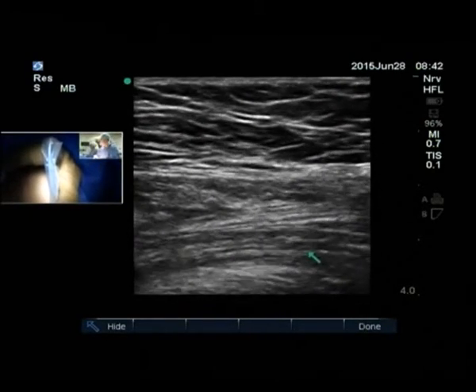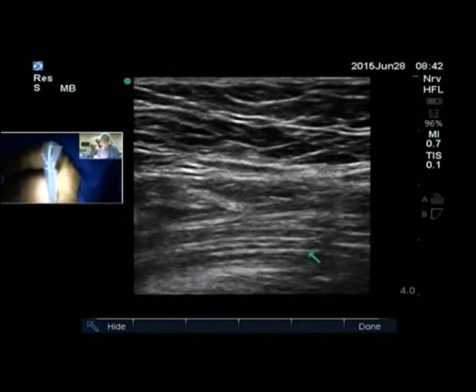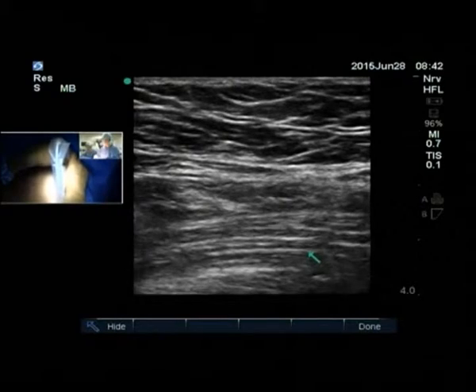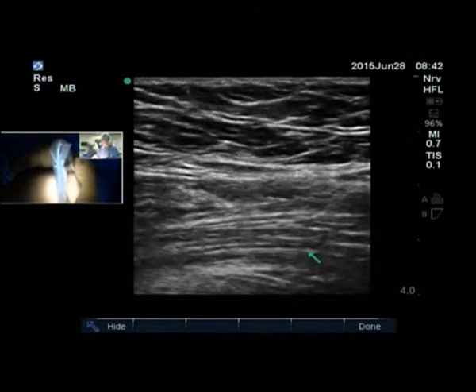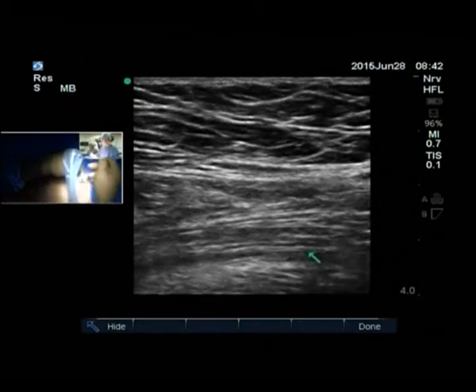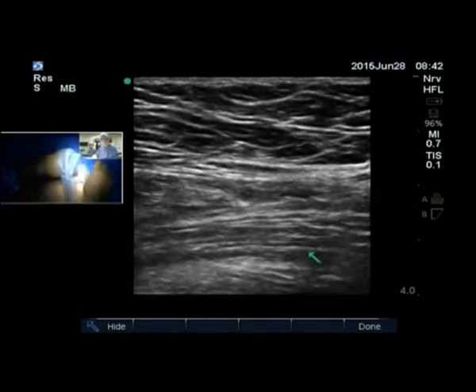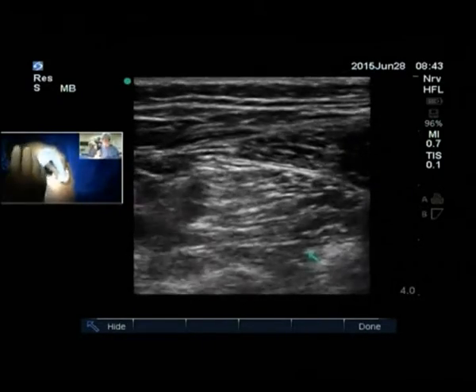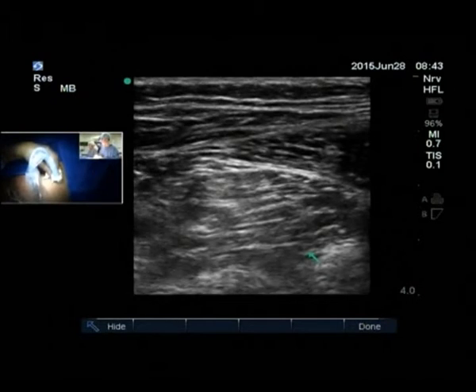Bala, there were 2 pops. There's local anesthetic above the nerve. So that's the longitudinal axis of the nerve, and the anechoic shadows show the spread of the drug. And if you have a catheter, you can actually follow as the catheter goes in. You can use this view to see how it moves along the course of the femoral nerve.